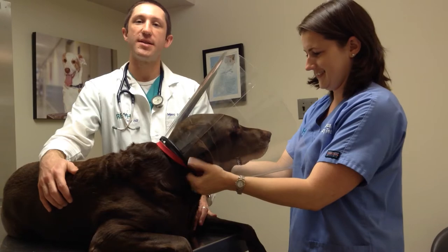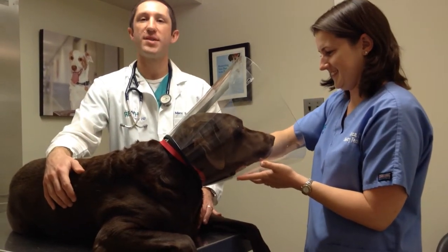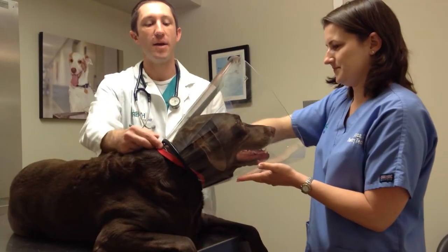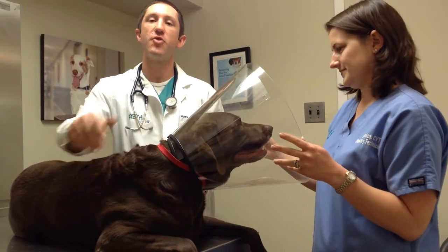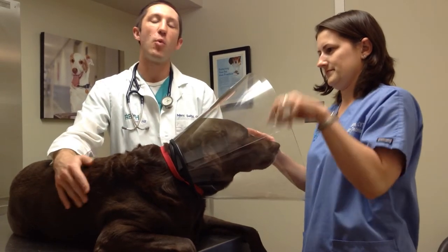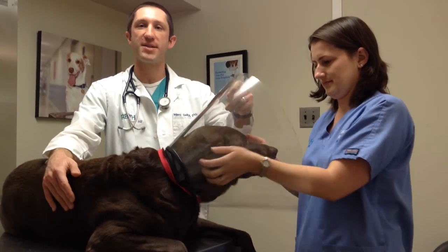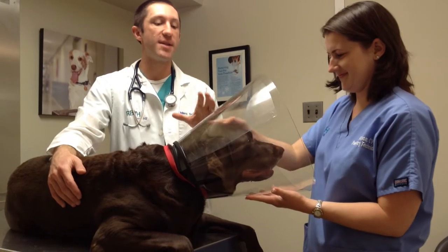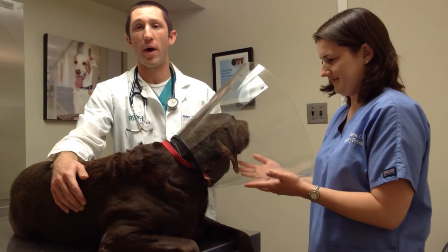One of the advantages to this clear one is it doesn't interfere with Sedona's ability to see. Some of the other ones that are tinted can be a little hard for them to get used to. You can see we can't pull it off of her, but it's still loose enough that I can get two fingers in. These are general principles that apply to all e-collars. Now one of the criticisms of the traditional plastic cone is that they're a little bit rigid and inflexible, although they do provide the most strength as well as the best protection for animals getting to parts. Some animals just don't tolerate them well.